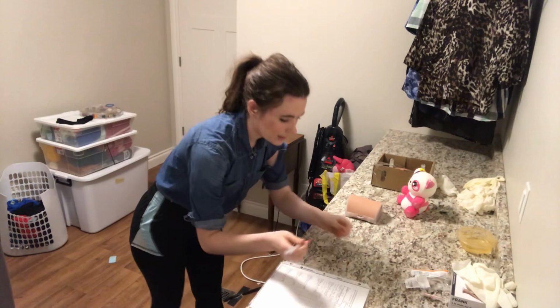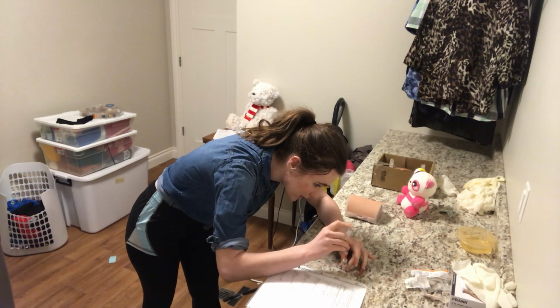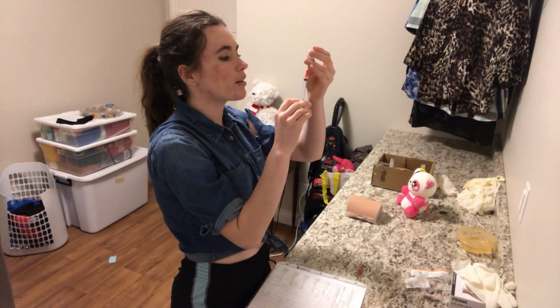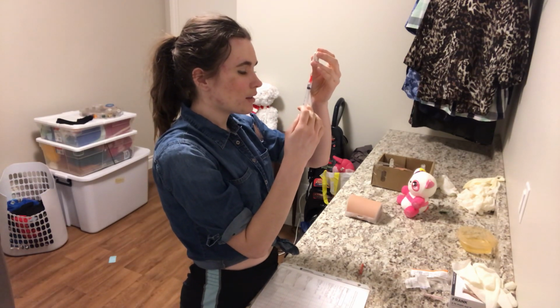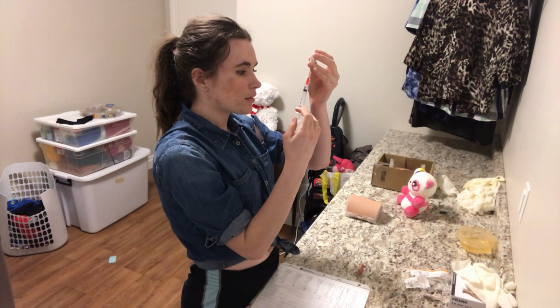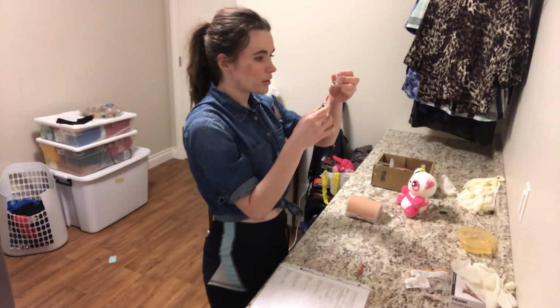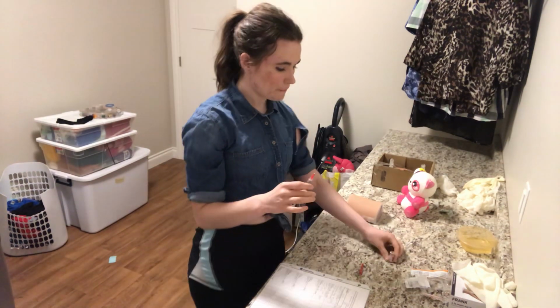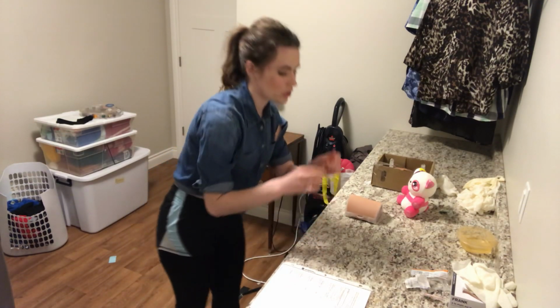Now I'm going to safely uncap, inject straight down, inject 1/2 ml of air, not water, flip, and get out my medication. Okay. So I'm going to withdraw, and I've drawn up a little bit more than I need, just so that we don't lose our accurate dose when we're changing needles.